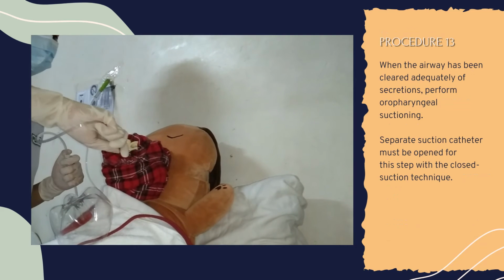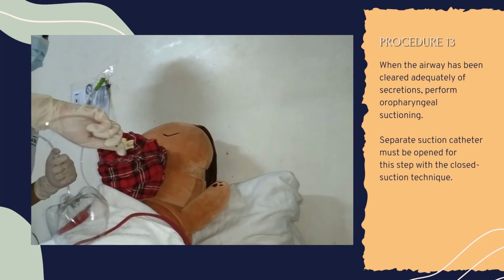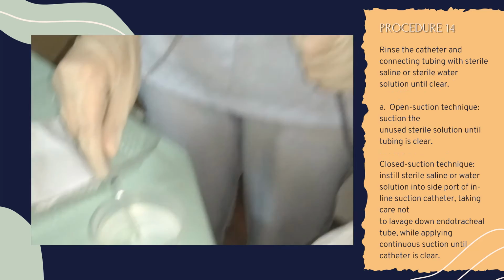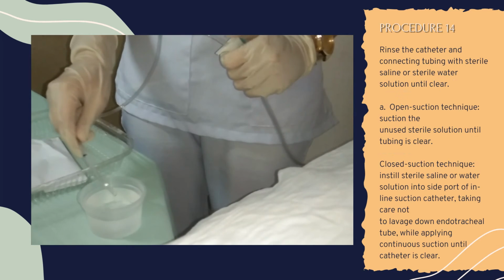When the airway has been cleared adequately of secretions, perform oropharyngeal suctioning. The suctioning of the oropharyngeal area may enhance patient comfort and should be part of an oral hygiene program.